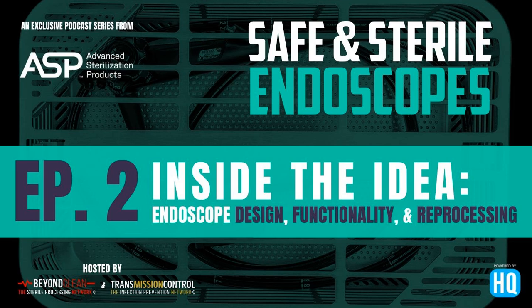That is a great scenario. As I always think of, GI is my love. So you always think if you've got AERs in that department, or ECRs as we call it for our Evotech platform. But I think back years ago that we were manually hand washing our scopes. We were doing the bedside pre-cleaning, going to the reprocessing area, and everything was done manually. And that was even before Scope Buddies and any other accessory little pumps that helped us standardize those flushes with enzymatic and then water and then air.